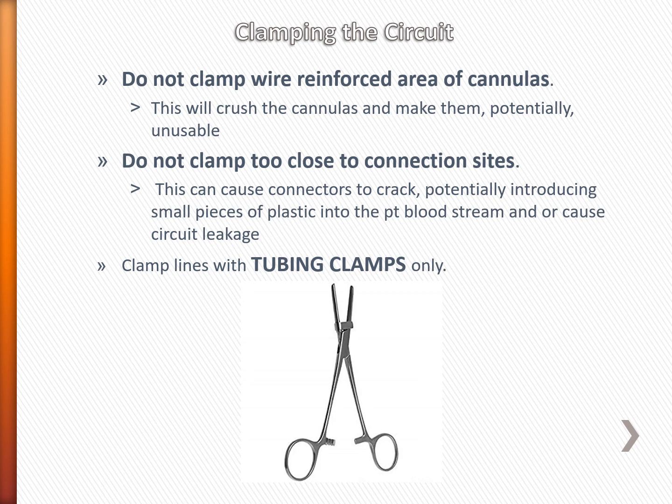So please make it a habit to check that you have 4 tubing clamps hanging on the circuit in case of emergency. Please, if you find regular clamps or ones with sharp teeth on them or scissors or anything else hanging on the ECMO, take it off because you'll regret it if you don't in an emergency. Regular clamps, or the ones that have sharp teeth, can be used to secure the tubing to the bed, but should never be put on the ECMO circuit because a warm ECMO circuit tubing will rip apart with regular clamps.